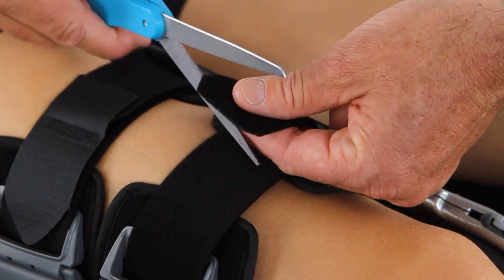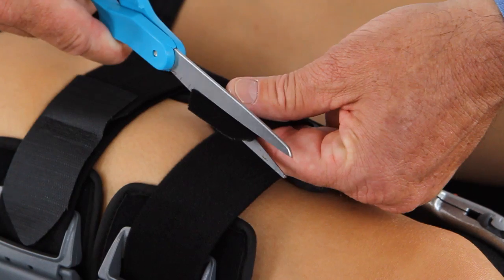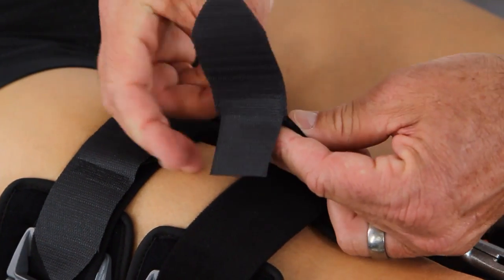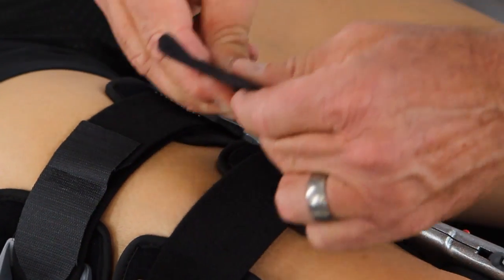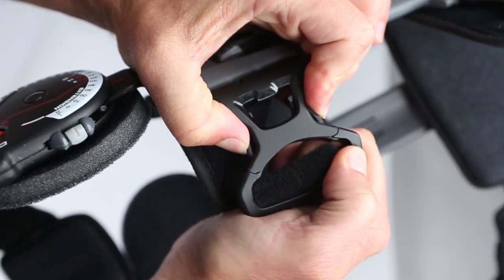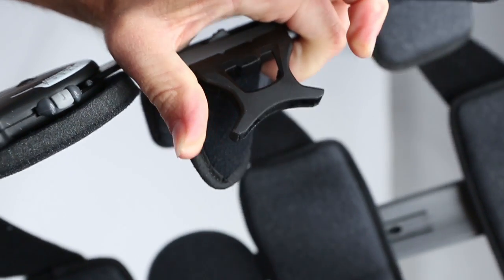Cut off or fold in any excess strap. If you cut it, reposition the alligator strap end to the new edge of the strap and secure it. To disengage each buckle, simply squeeze both sides of the buckle until it releases.